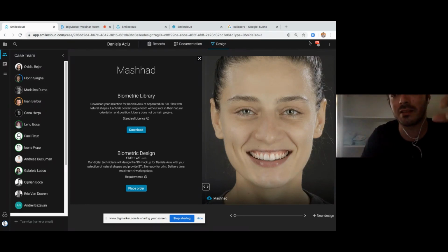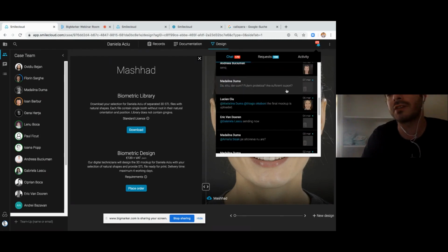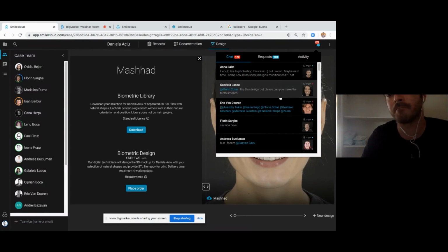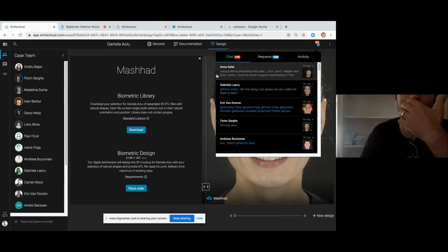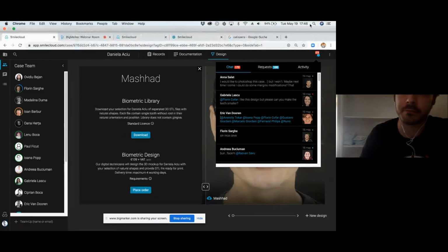I think this is crucial, because then you just go and on your phone you have notifications with everything that's happening around your patients. It's invaluable to the presentation.